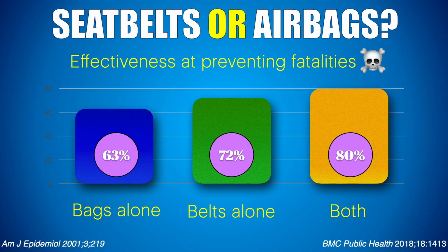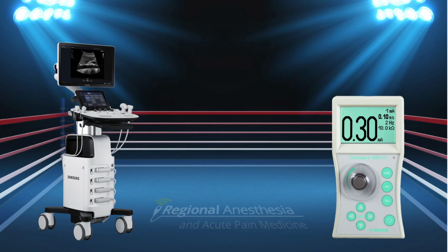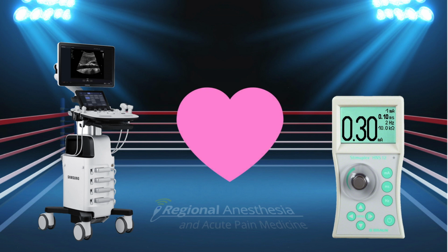Anyway, the data is out there on both seatbelts and airbags, and they work in a complementary manner because they don't work in the same way. And that's true for ultrasound and nerve stimulation. They give us different information and protect the patient in different ways. So I reject this idea that it's a competition between these two things. It's a love affair, and we should be celebrating how well these two technologies work together.